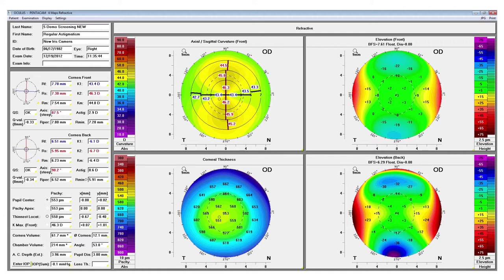This display also gives you several measurements such as keratometry, pachymetry, anterior chamber information, and horizontal white to white measurement.